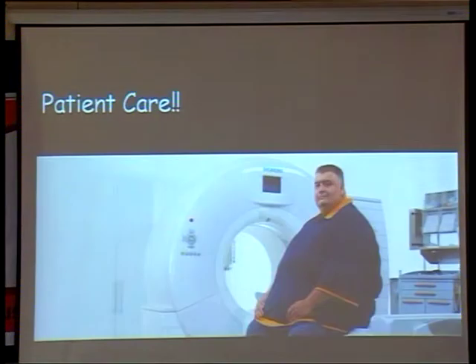So this is what patient care is. You can see he is an obese patient. Nowadays a CT is available with a wide bore. Earlier it used to be a shallow bore, where the opening was smaller. Nowadays we have a wider bore, so even an obese patient can go inside without feeling claustrophobic.